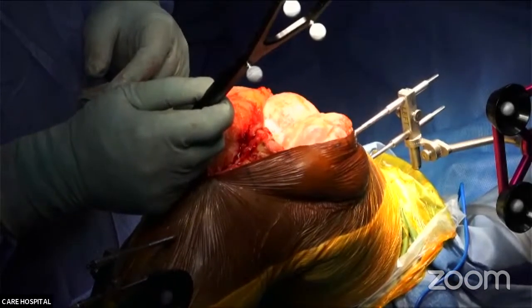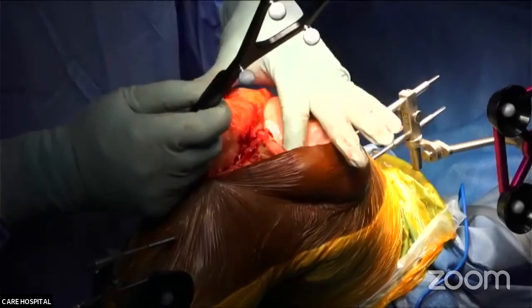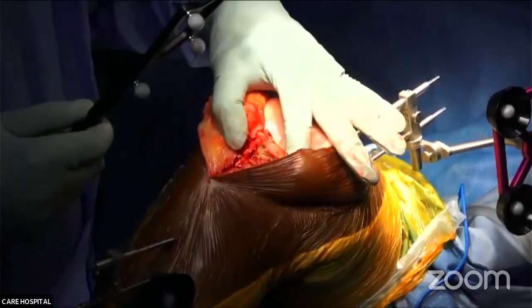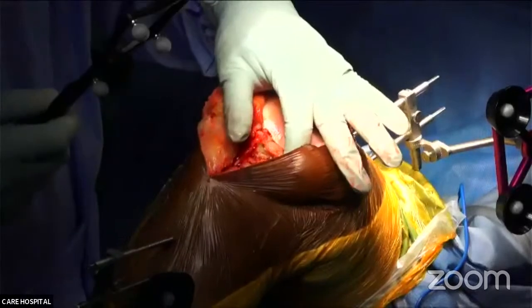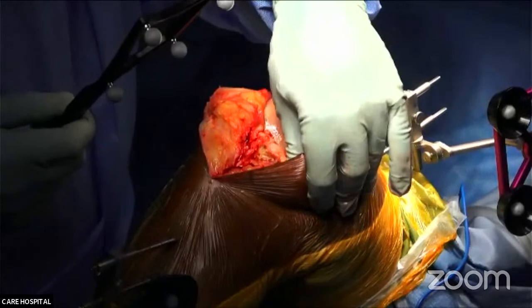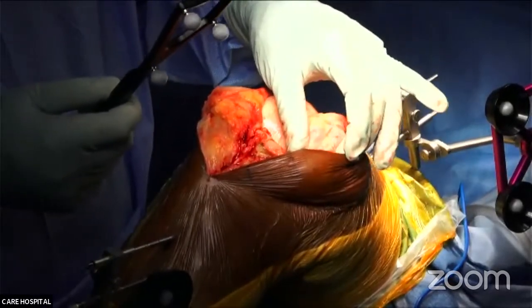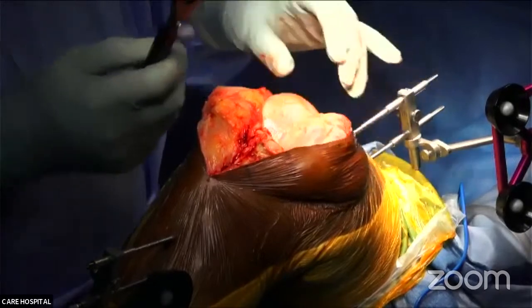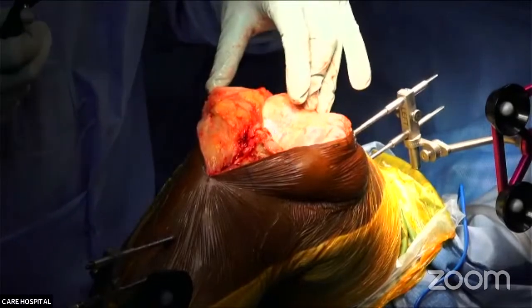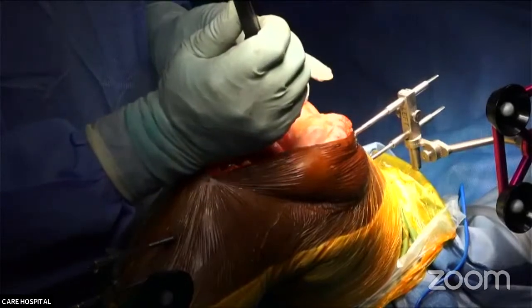You may or may not remove the meniscus before. You may or may not cut the ACL, PCL. Basically, while doing the CT scan, CT has taken into consideration only bones. It has not taken into consideration the cartilage, that 1 millimeter or 1.3 mm thickness of cartilage. It has not taken into consideration the meniscus. So if you are mapping over the meniscus, your stylus should pierce the meniscus and reach the bone. After that, the burr will come. It will just cut everything.